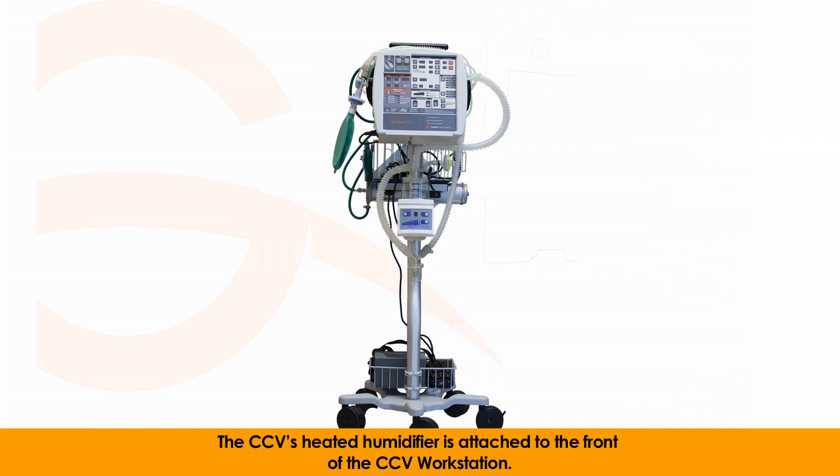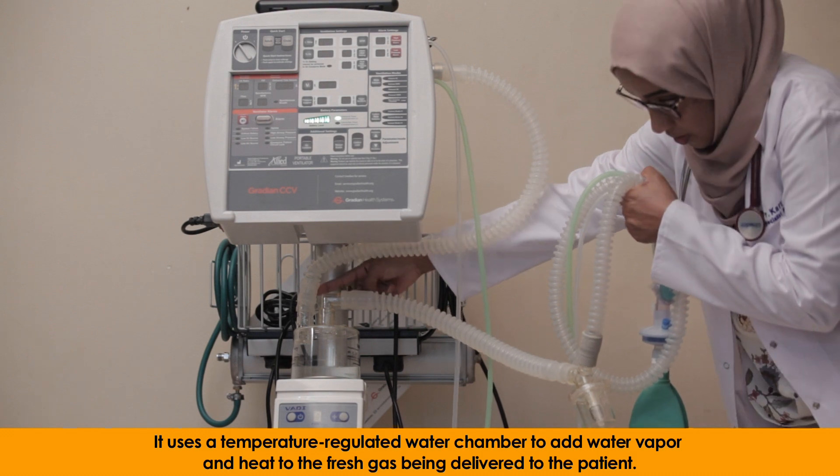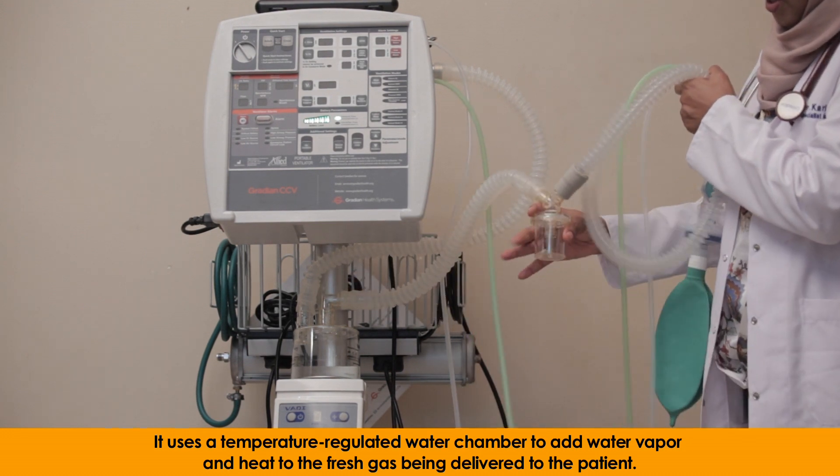The CCV's heated humidifier is attached to the front of the CCV workstation. It uses a temperature-regulated water chamber to add water vapor and heat to the fresh gas being delivered to the patient.